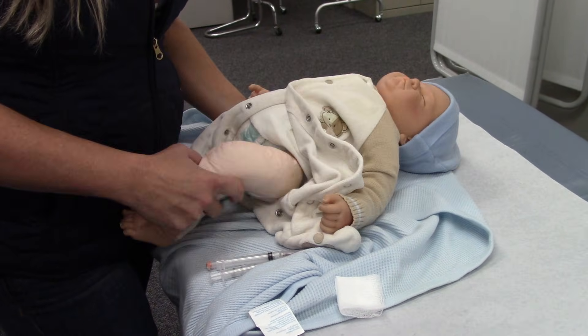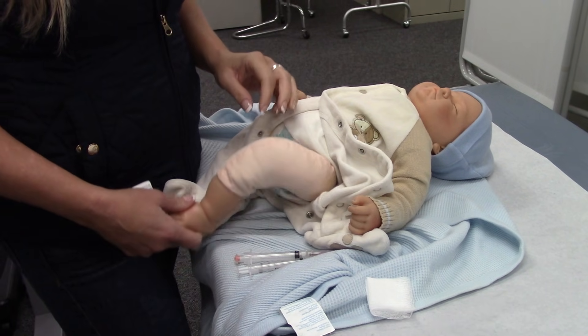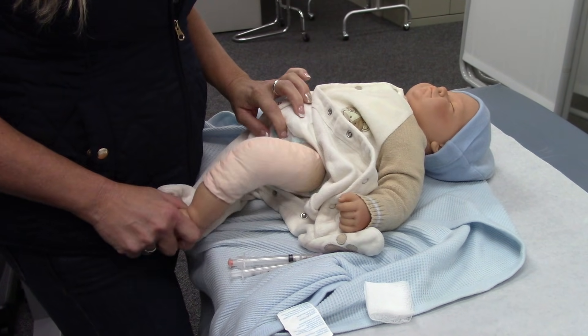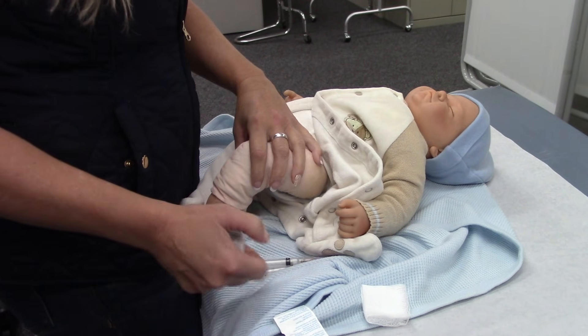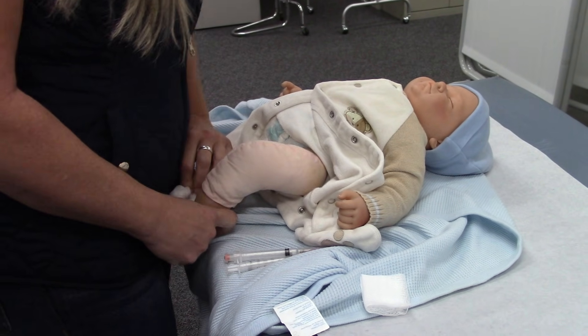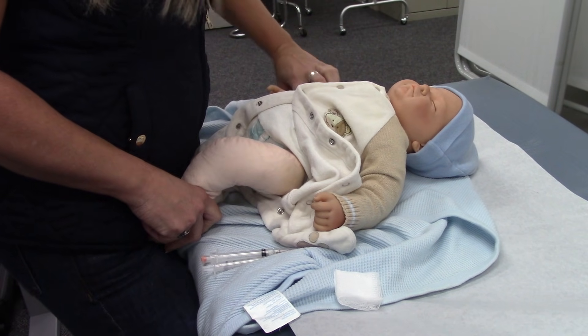For intramuscular vastus lateralis, we need to make sure that the leg is bent. Bent means that it is relaxed. So if you're doing it by yourself, you're going to hold your baby's legs bent up here.